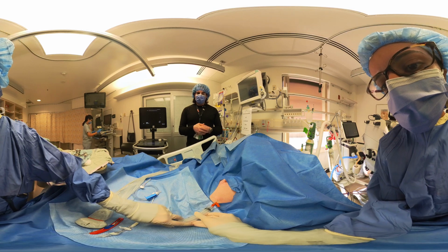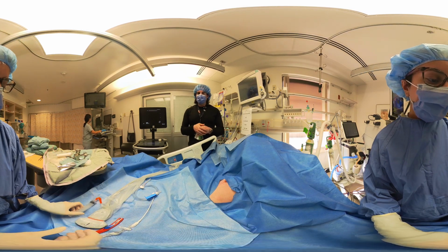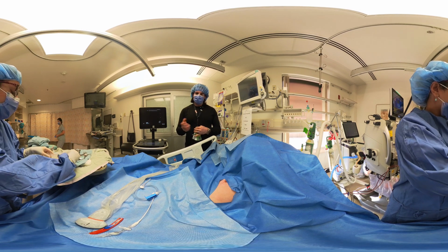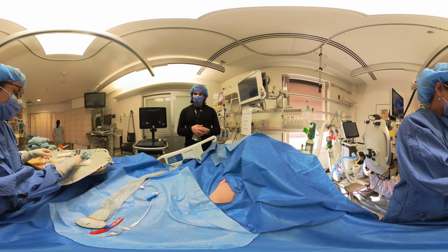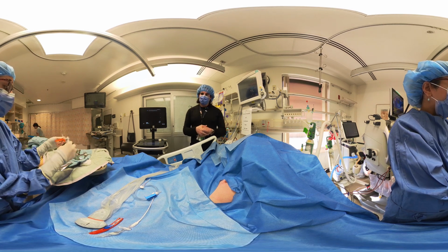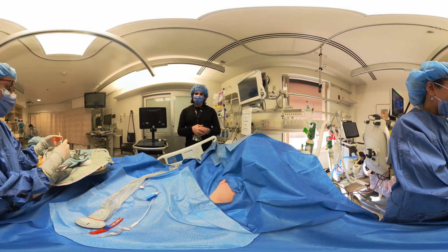Perfect. So at this point, you can change to a longer needle to get down to the rib periosteum and to the pleural space. So we will switch to a longer needle, and normally it's also a bigger gauge as well, so this is probably a 22 gauge.